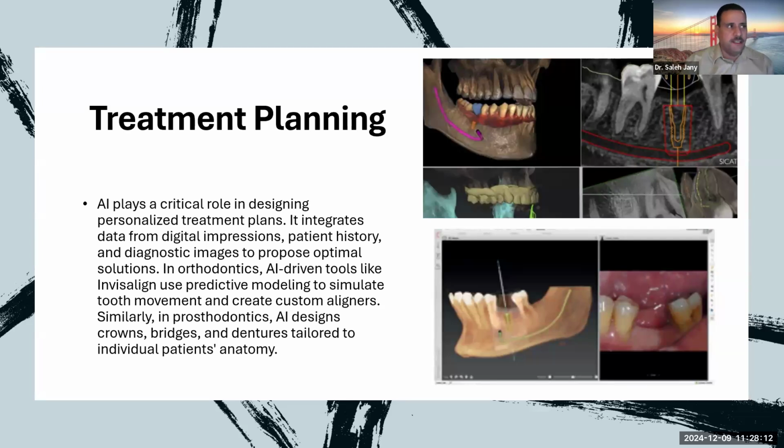The AI makes it easier because it will calculate all these variations, the limiting vital structures, the amount of bone remaining, the amount of gingiva remaining, how much space, the size, and angulation. It saves you a lot of time on preparing and diagnosis.